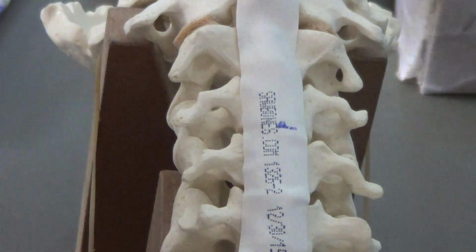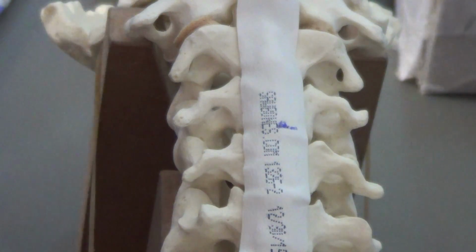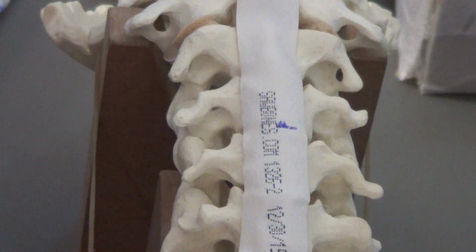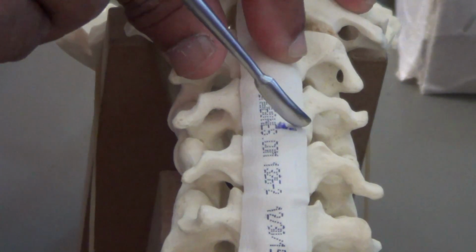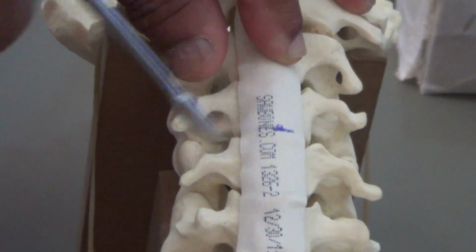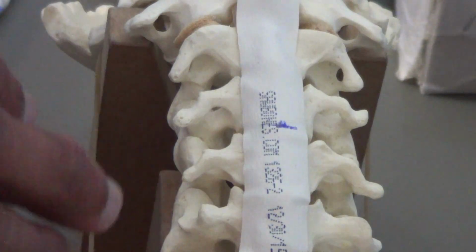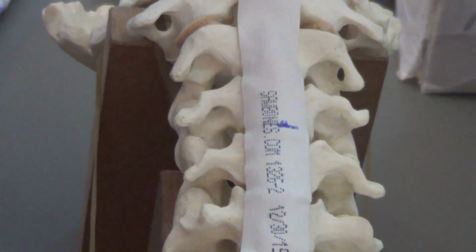Then what you do, you have a knife, and you cut the anterior longitudinal ligament. But before that, usually you put a distractor.